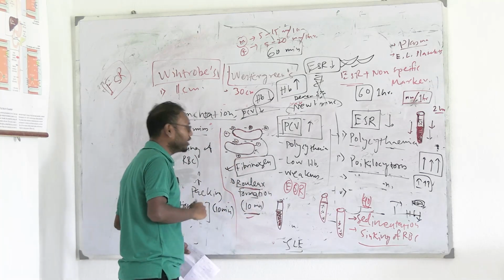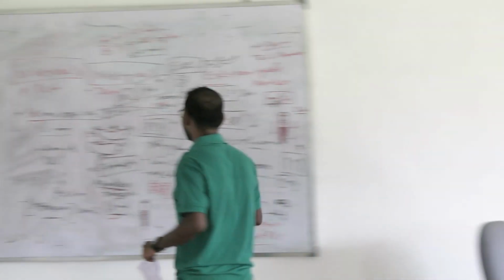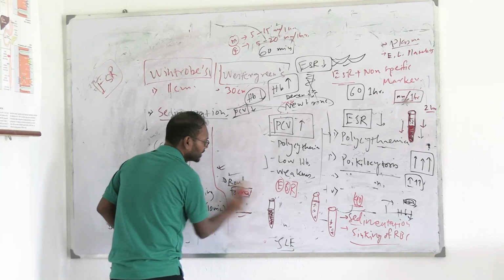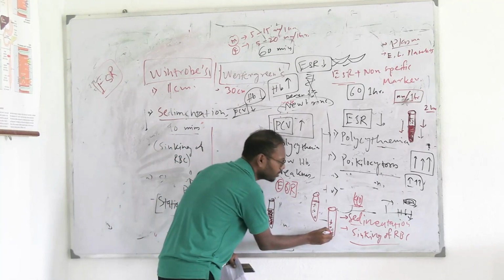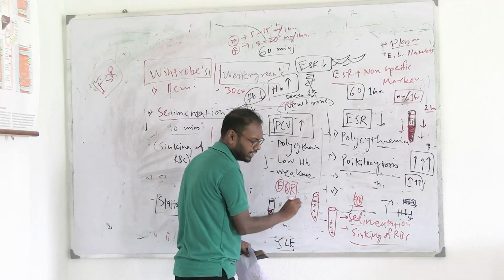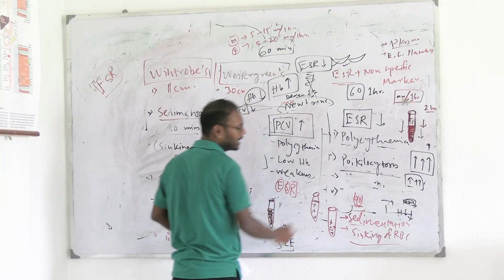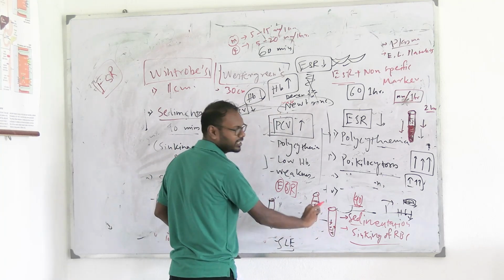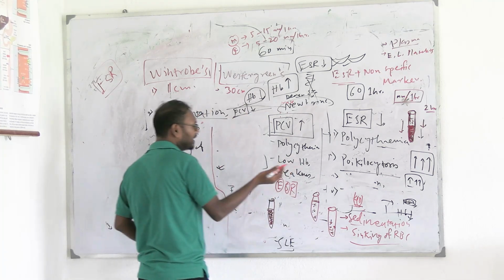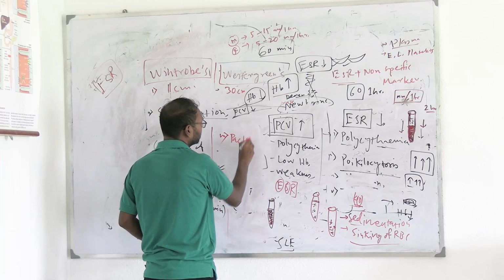This is called your packing of RBCs. The term packed cell volume that we use, this term comes from there. Now think, these cells have sunk down the test tube, but they are not stable yet. They have formed rouleaux for 10 minutes, they have sunk down and gotten below in the test tube, right? So what happens, they now need to be packed to each other and create a stabilized sediment. So that is the third procedure. So this is packing of RBC.